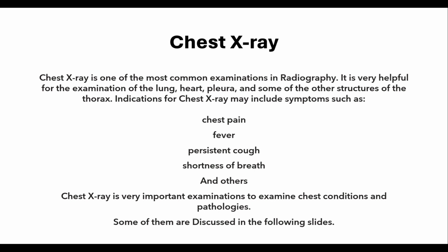Chest X-ray is one of the most common examinations in radiography. It is very helpful for the examination of the lung, heart, pleura, and some of the other structures of the thorax. Indications for chest X-ray may include symptoms such as chest pain, fever, persistent cough, shortness of breath, and others. Chest X-ray is a very important examination to examine chest conditions and pathologies. Some of them are discussed in the following slides.